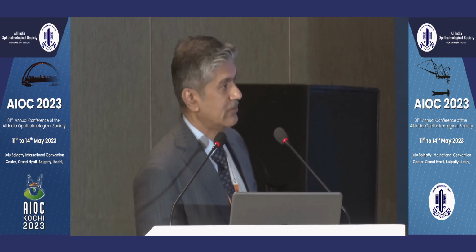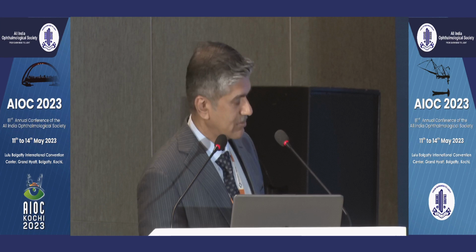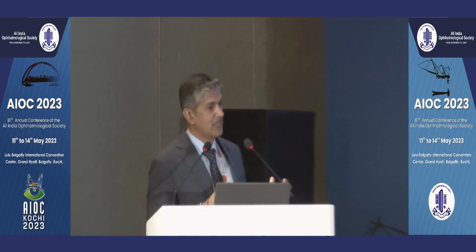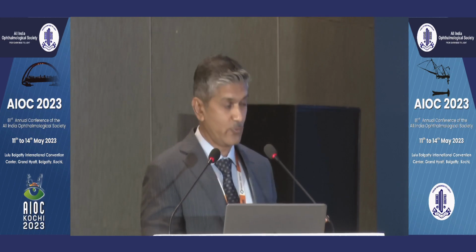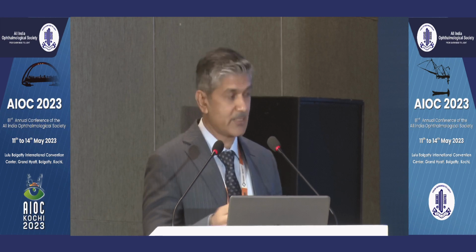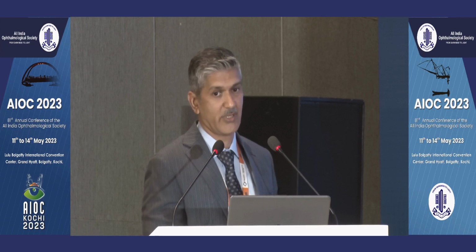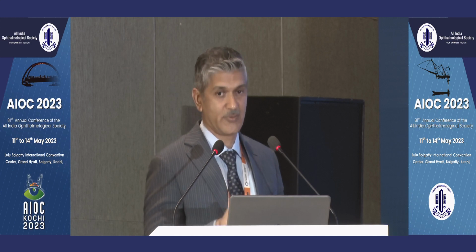Yeah. The hyperopic SMILE. Would you suggest doing an extra procedure on the cornea in any hyperopic cases to have better stability over a period of time? Yeah, for younger patients, we prefer, because in younger patients regression is more because of the epithelial hyperplasia and also the corneal biomechanics. In SMILE, the corneal biomechanics are better than LASIK, so that's why we see less regression. But if you add cross-linking, then probably the late regression will be less. So we probably need to do studies where we combine cross-linking with hyperopic SMILE and look at the long-term results, especially in young patients.